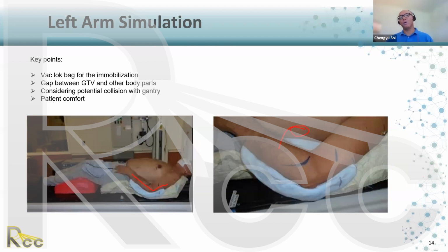It happened once, the patient got a skin toxicity, and we wondered how come. You are treating the arm, how come the body has a problem? Then we found out that either the arm was adjusted too much in and out, or the beam diverted into the skin area. So don't use too much. And do use your common sense to check the patient setup.